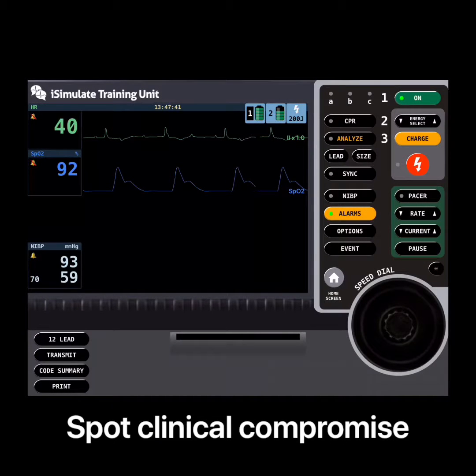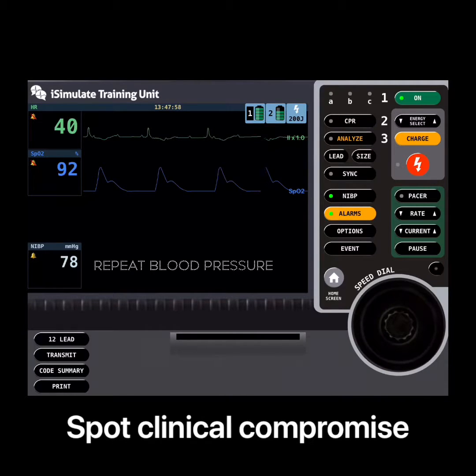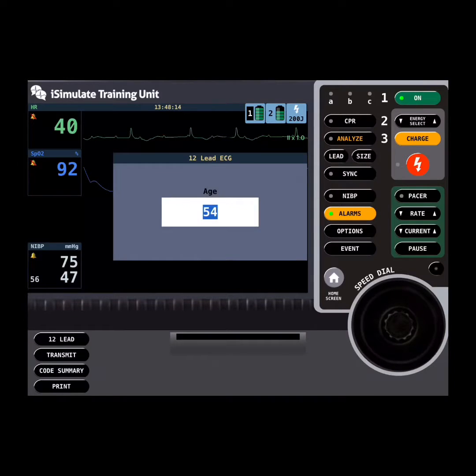They started to manage the patient and then the patient actually went off — they lost their airway — and the team recognised that and started some basic airway management. Somebody pushed the NIBP button and repeated the blood pressure, and we'll see here that the blood pressure has now started to sink quite low. So they've got what they think is a third degree heart block, which has been confirmed, the patient still has relatively low saturations, and now a compromised blood pressure.